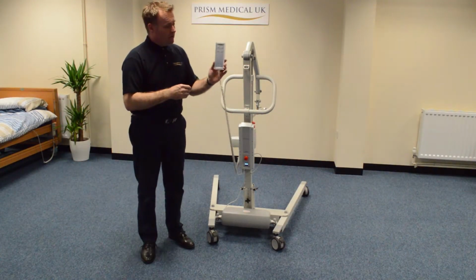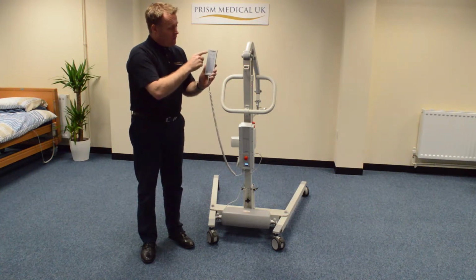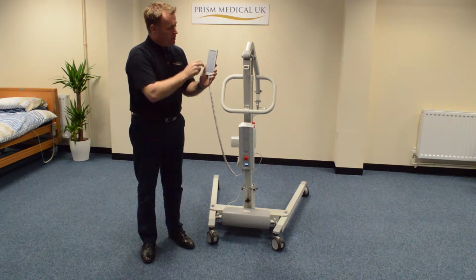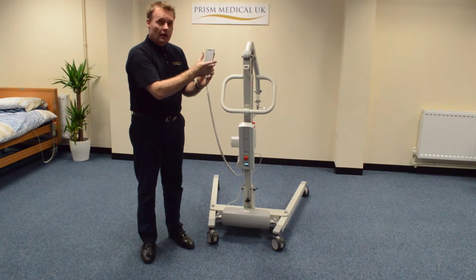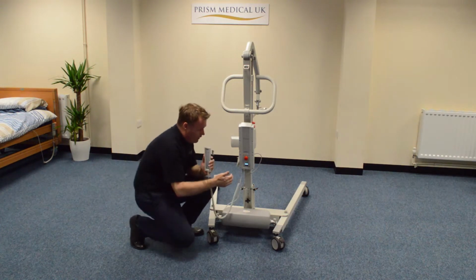The hoist is operated via the handset. The handset is diagrammatic, with each function being clearly displayed by the form of a picture. So we've got the carry bar going up, carry bar coming down, legs opening, legs closing. The handset is connected to the control box.